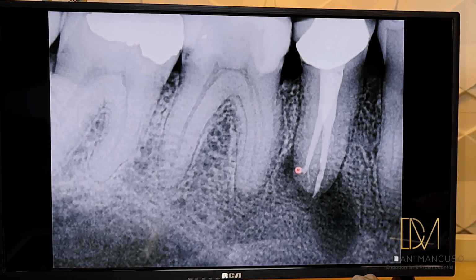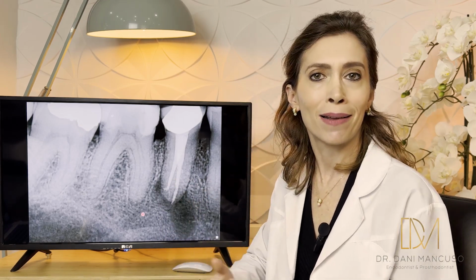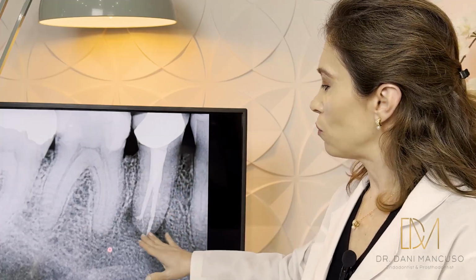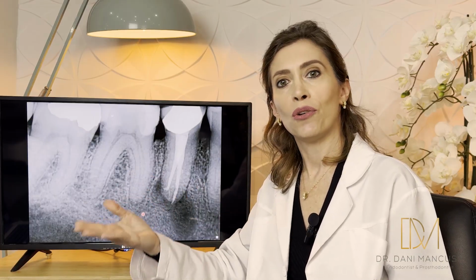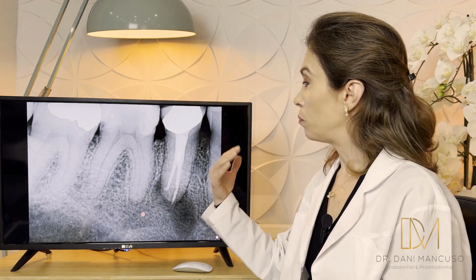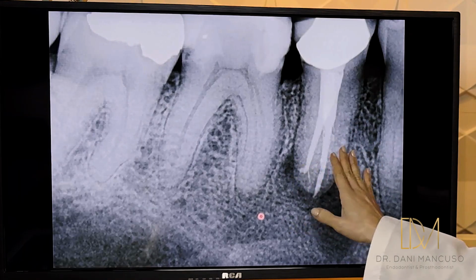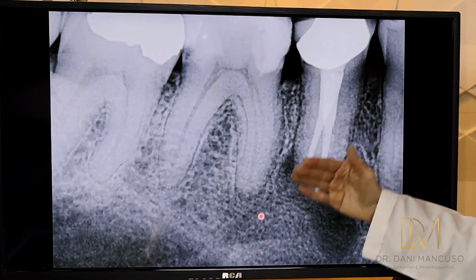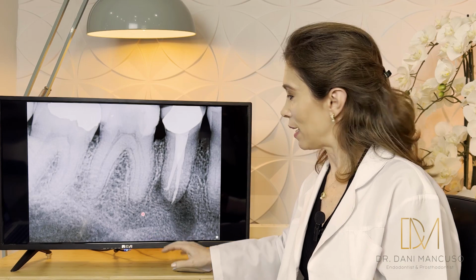and the sealer going that way. So it's quite complex in this area. So make sure you disinfect it properly. We'll be talking about disinfection as well in another episode. Once the root canal treatment is finished, the disinfection, then you are ready to obturate, and you can use warm vertical condensation or the single cone, which is a lot easier. Once it's all disinfected and obturated, it's time to do the coronal seal and monitor that case.